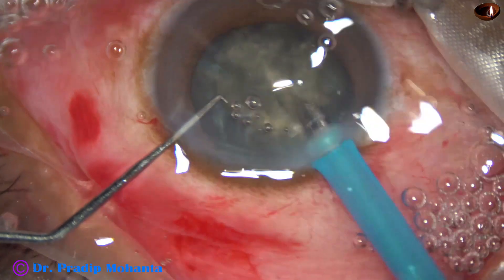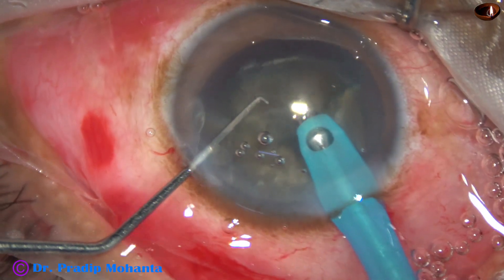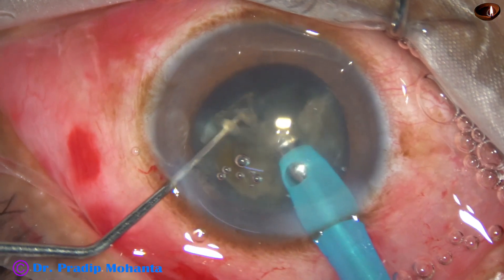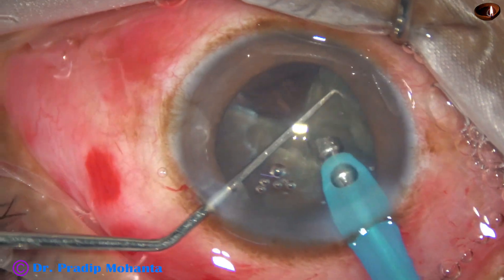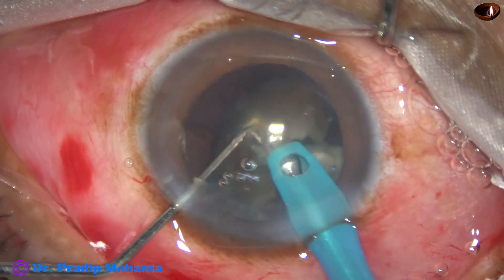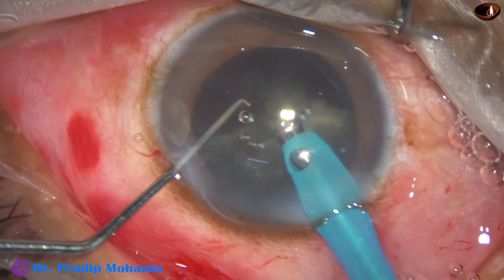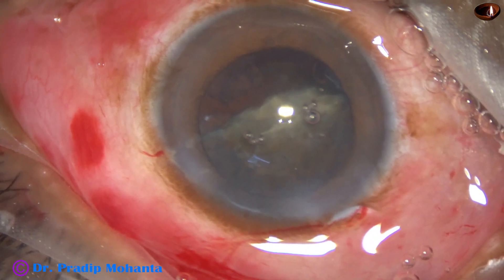I go again with the handpiece and start emulsifying this piece from the apex. This nuclear piece is emulsified. From the beginning, the settings are as follows: ultrasonic energy is set at 80 percent in continuous mode, flow rate is 45 ml per minute, and vacuum is 450 millimeters of mercury. Two pieces have been removed — one hemi-nucleus has been removed.